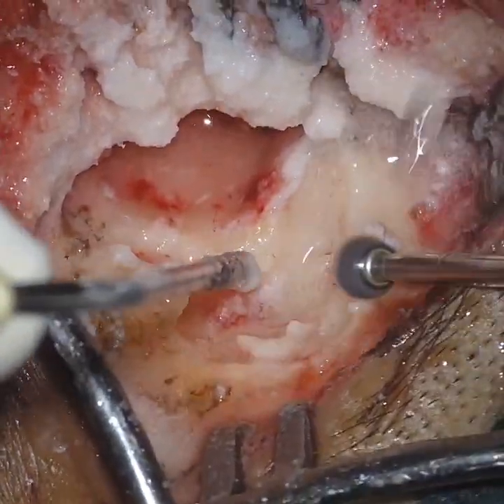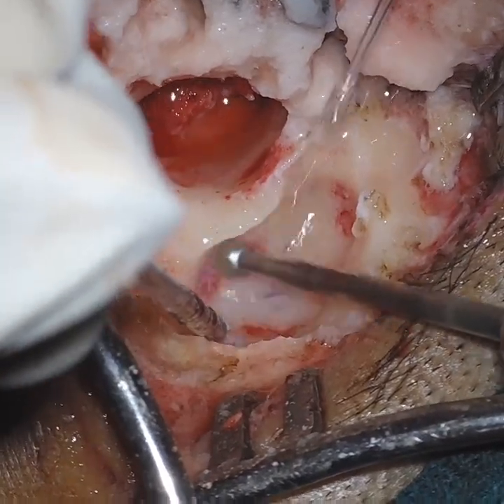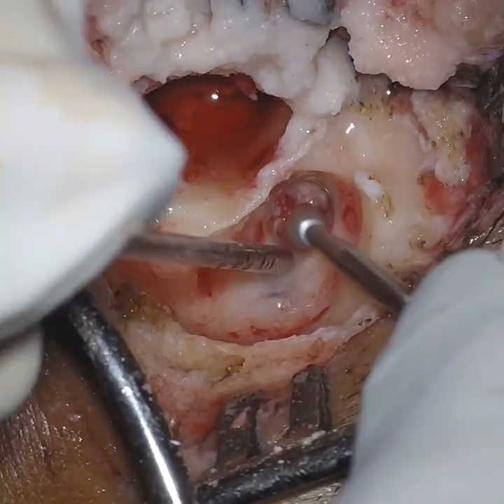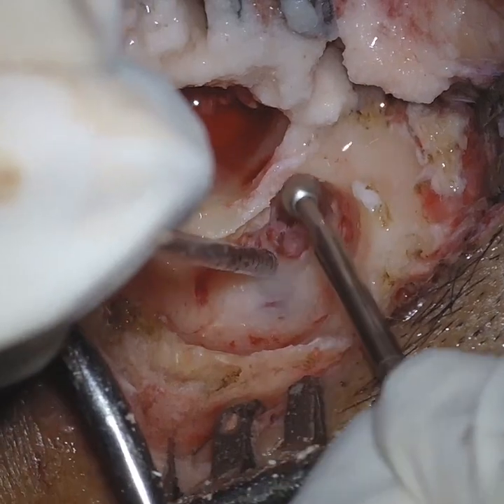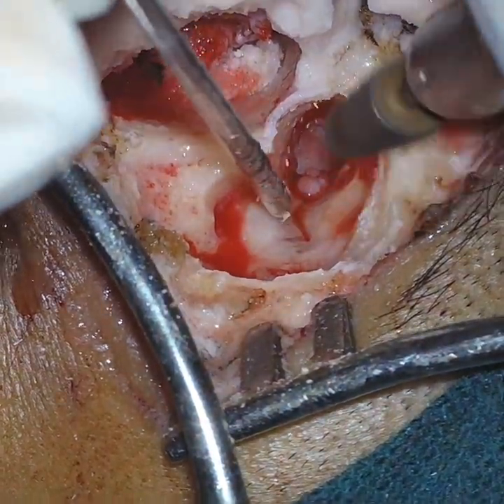the ossicles. So it was decided that this patient has to go for an intact canal wall mastoidectomy since the patient was young and we didn't want to give a cavity to the patient, and the middle ear mucosa was also in good health. So we decided to remove this hypertrophic mucosa with the intact canal wall mastoidectomy.